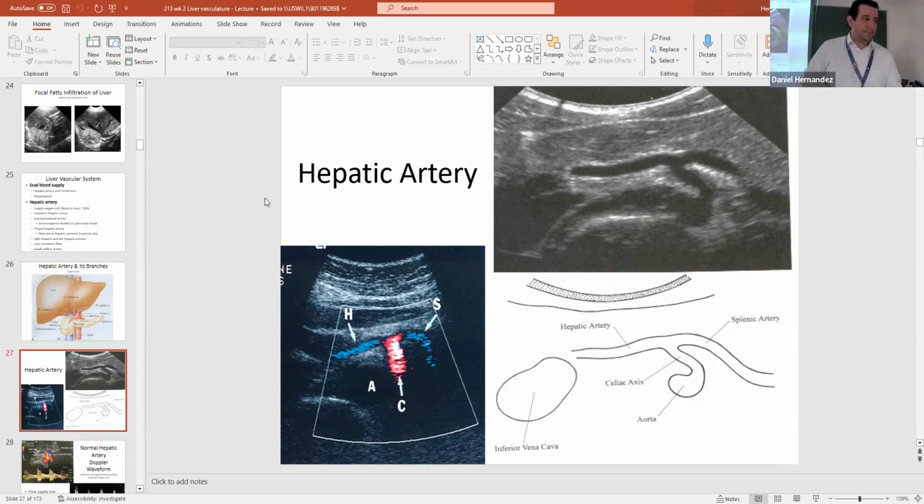Is that the seagull? Yep. That's what I had on Kindred. She's a good scan for this. It does look like it in color. You don't see a bird? No, a T? Looks like an IUD. Like the M. Didn't you used to draw birds like this? I still draw birds like that.